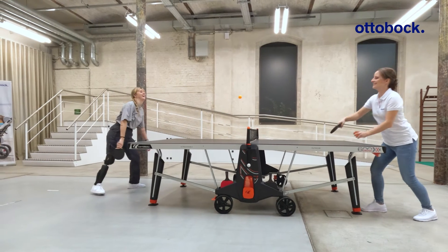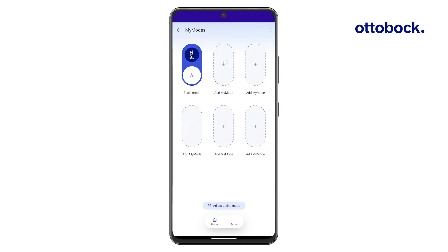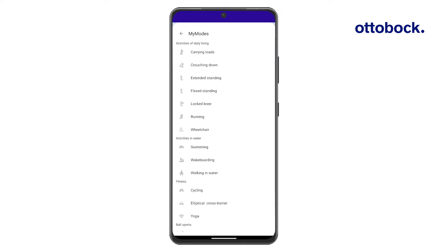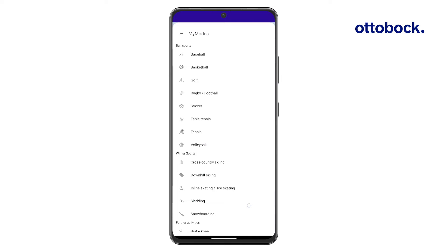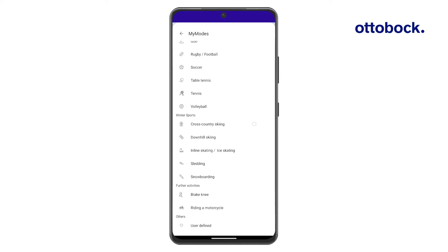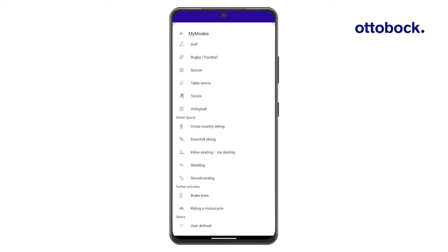To add a new MyMode, tap the plus button in the ConnectGo Pro app and select a preset from the list. To create a MyMode from scratch, use the user-defined preset.